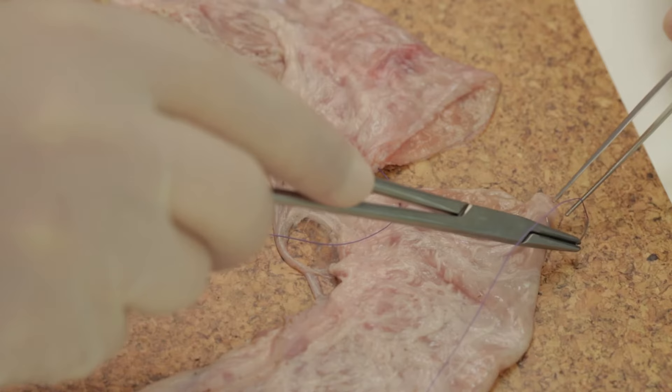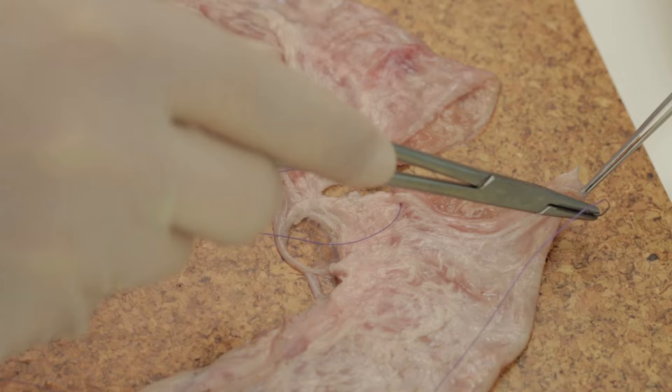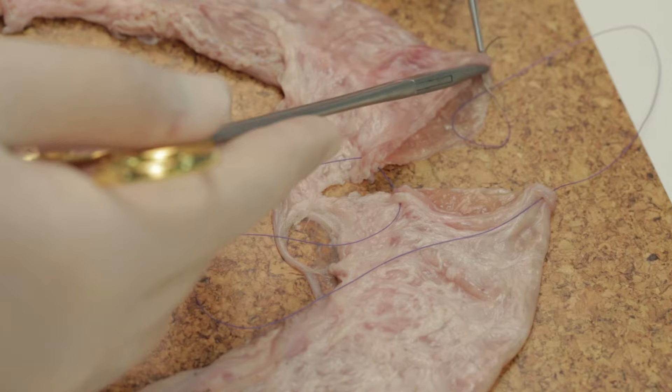Now the needle is taken again, and the suture is placed on the opposite end of the cut bowel. This again will be used as a stay suture.